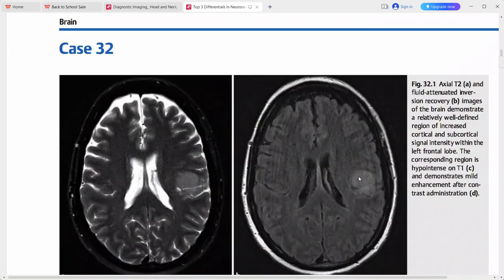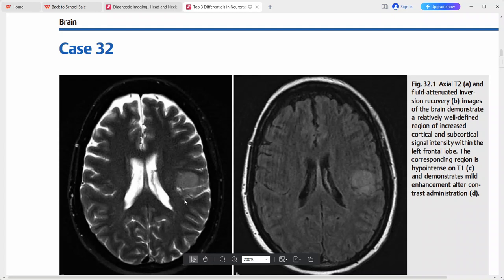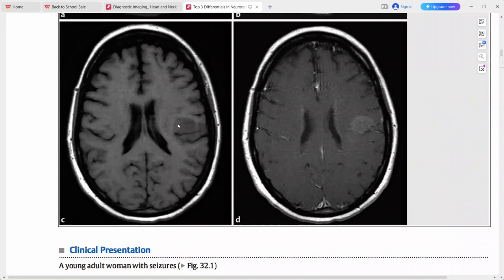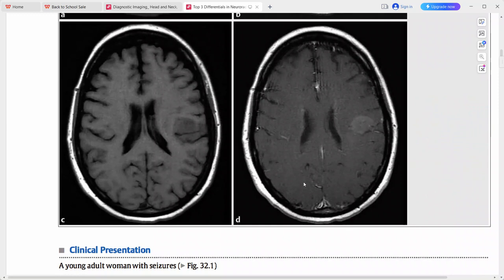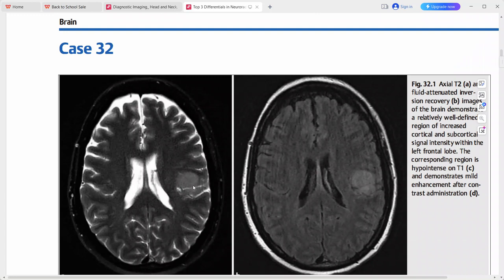This is a case of a young adult woman presenting with seizures. On axial T2 and FLAIR sequences there is a relatively well-defined region of increased cortical and subcortical signal intensity within the left frontal lobe. It is hypointense on T1, shows mild enhancement after contrast, and is hyperintense on T2 and FLAIR.